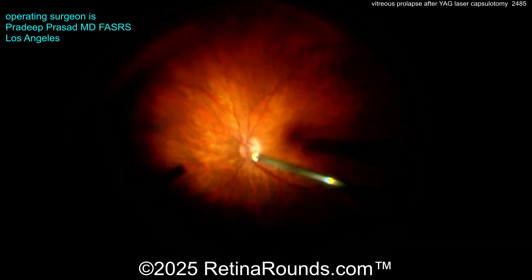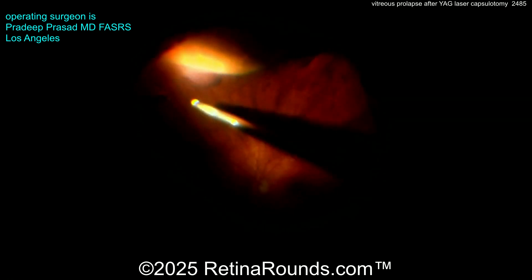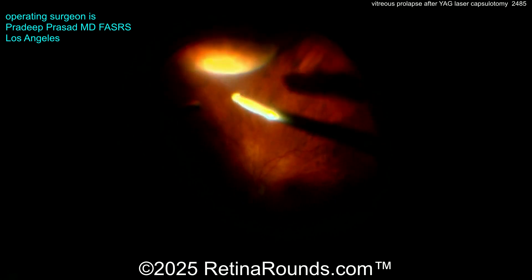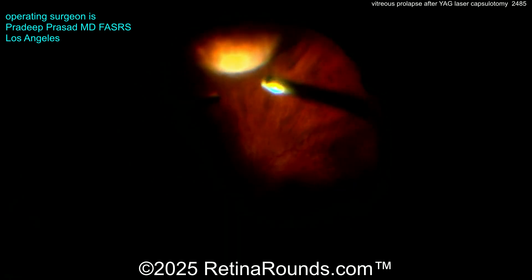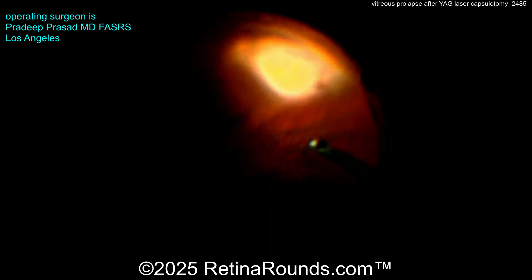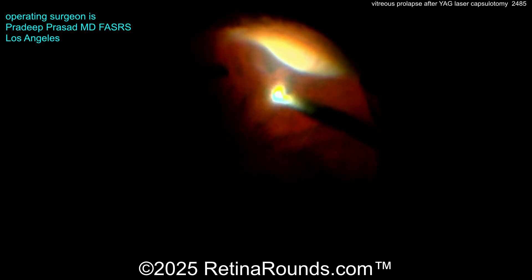Here you can see we're just double-checking to make sure that the PVD has been induced. Then we're going to move on to shaving of the peripheral vitreous. You can see the assistant is depressing the scleral surface and we're shaving the vitreous base. This is going to decrease the chance of the patient developing a retinal tear or detachment later on, and will allow us to identify any peripheral retinal pathology that may need to be treated.